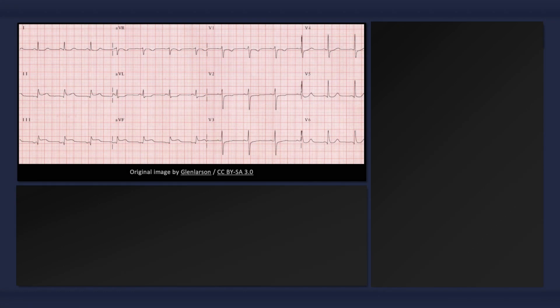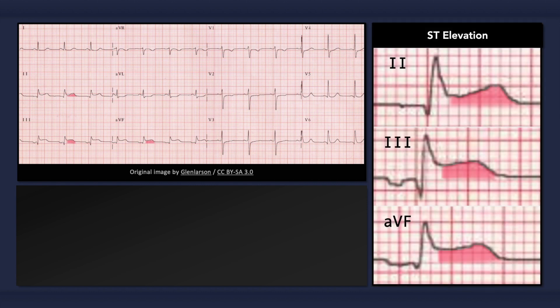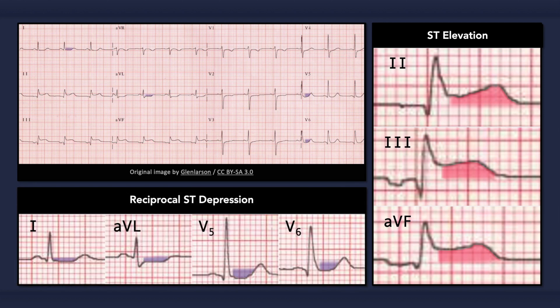To quickly recap, the main ECG findings that can occur with an isolated acute inferior MI include ST elevation in leads 2, 3, and AVF, and reciprocal ST depression in leads 1 and AVL, and sometimes V5 and V6 too. Remember to consider the analysis of right precordial leads because of the common co-involvement of the right ventricle.